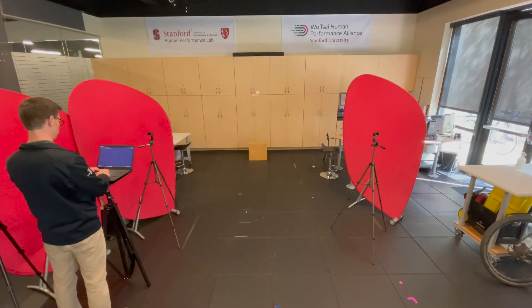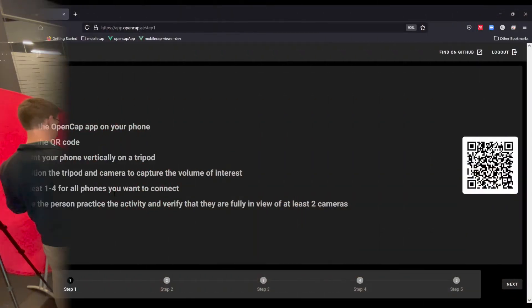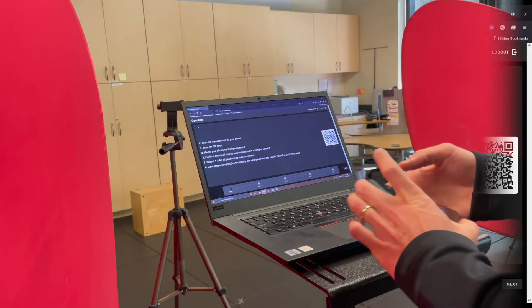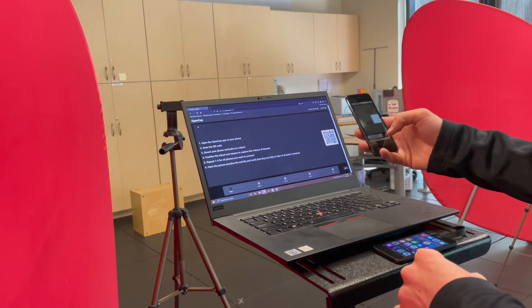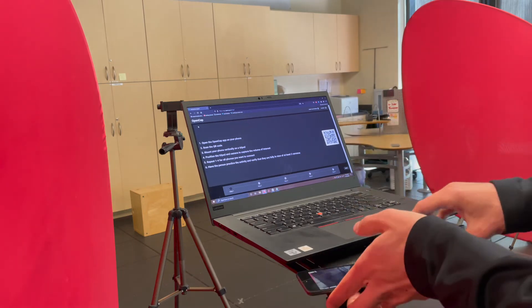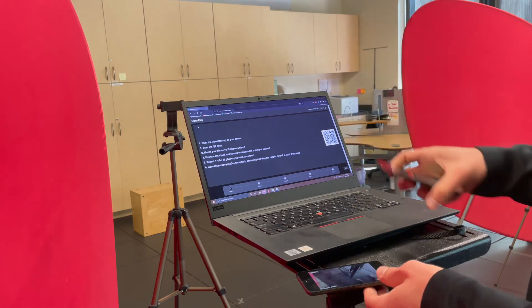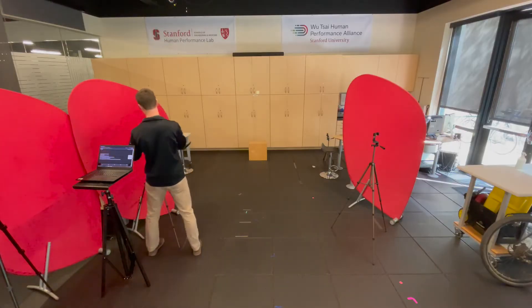When calibrating for an OpenCAP data collection, log on to the web application and start a new session, where you'll be provided with a QR code. Open the iOS application on your iOS devices and scan this QR code to synchronize them with the session.